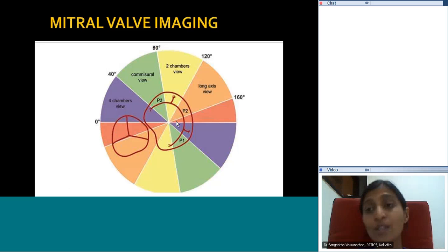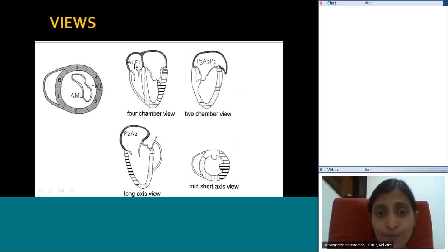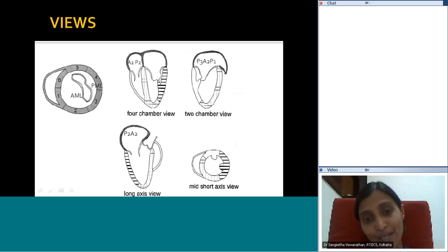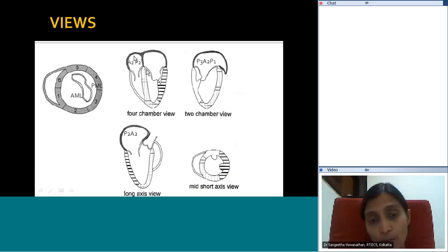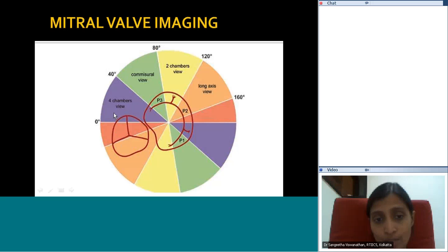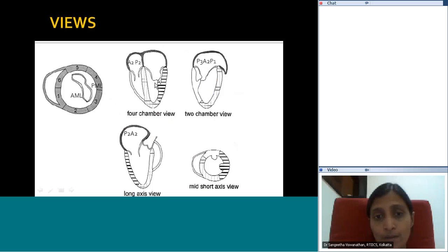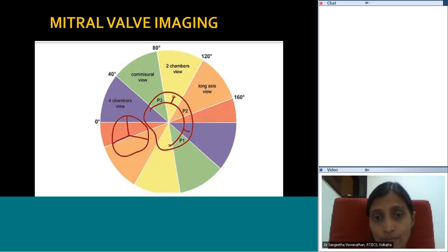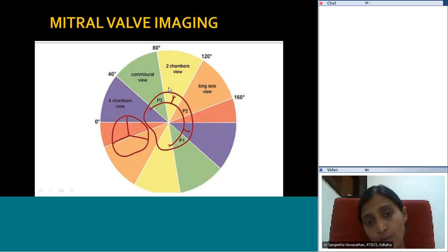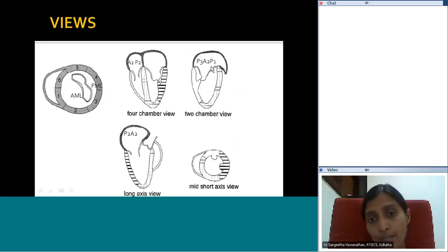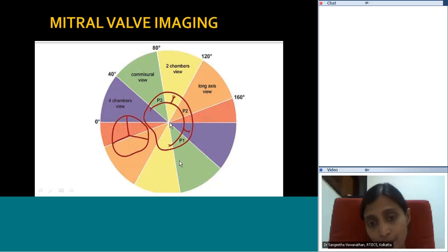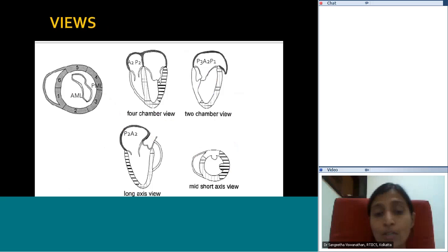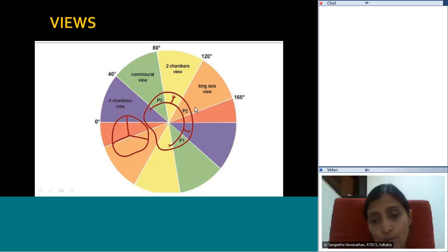Correlating with echo images: on the four-chamber view at zero degrees, you see the LA, LV, A2, and P2. Increasing to about 40 degrees cuts through A3, A2, and P1. The bicommissural view at around 60 degrees shows P3, A2, and P1. The two-chamber view at 90 degrees cuts through P3, A2, and A1. In long axis you have P2 and A2. These correlate with the schematic, making it much easier to understand the anatomy when performing the scan.